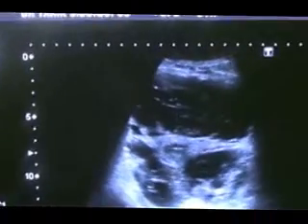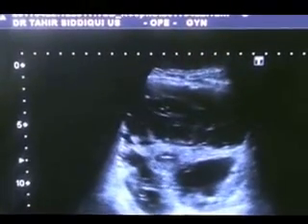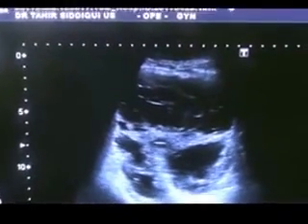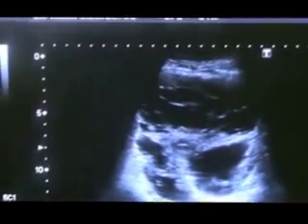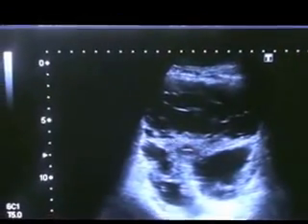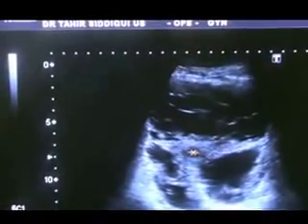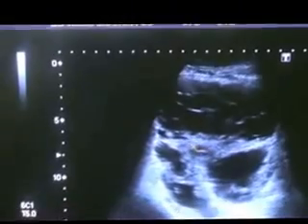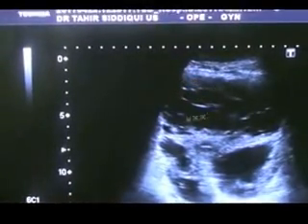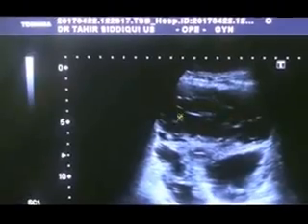27 years old female with a history of infertility. I have focused the transverse section of the pelvic region. You are seeing the uterus with central endometrial canal in very early proliferative phase. It's surrounded by fluid with septas.